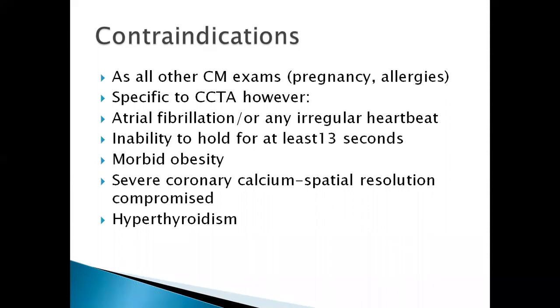So when the patient comes to book the examination, you may also want to explain the procedure. You may tell them how to do breath holding and whatnot, but then sometimes they may have conditions where they can't hold their breath for 13 seconds, or maybe even less than 10 seconds. If it happens like that, again, you have to call the doctor and explain to him that this patient can't actually hold their breath. So this examination, even if we have to go ahead and do it, will not be diagnostic.